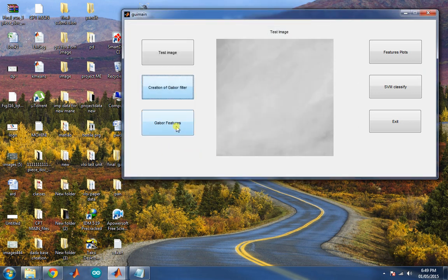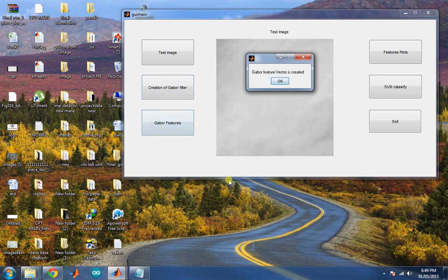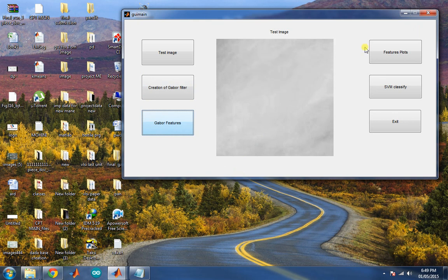Extract the features from the given test image. Now features are extracted. Next task is to plot the features.